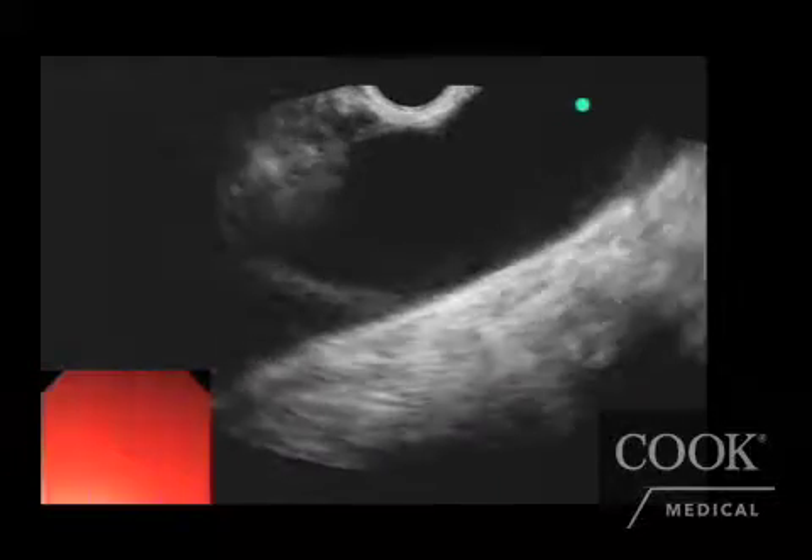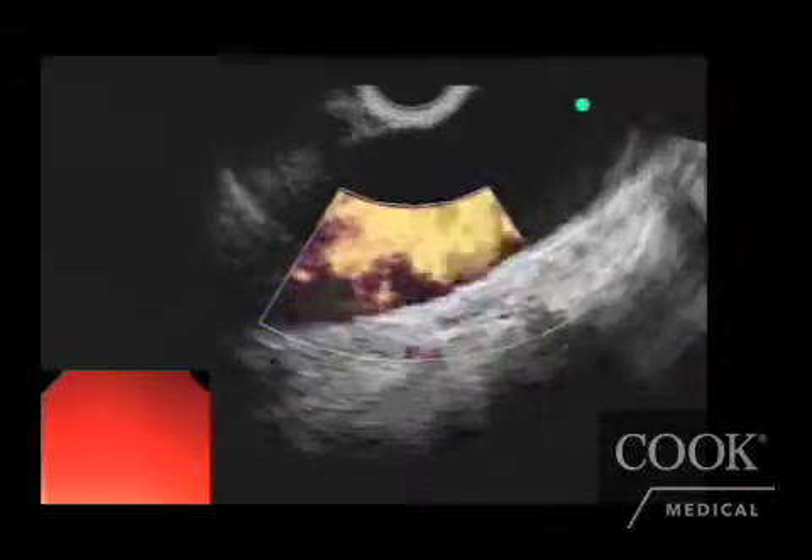The landmark we look for is the descending aorta at about 35 to 40 centimeters from the incisors. The descending aorta is a tubular organ, as you see here, with color Doppler ultrasound. Once you identify the aorta, you push forward with the echo endoscope until you find the first branching artery, and that's the celiac artery.